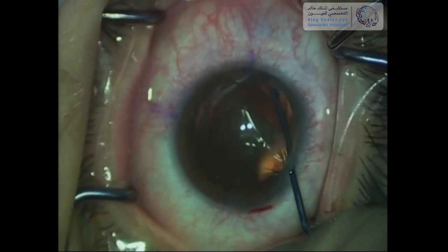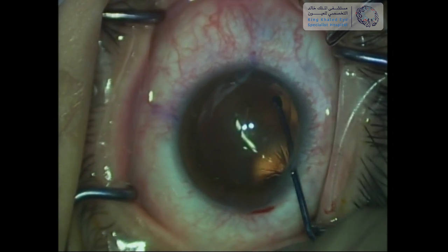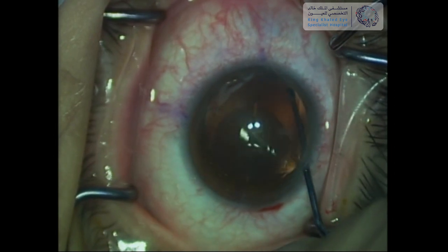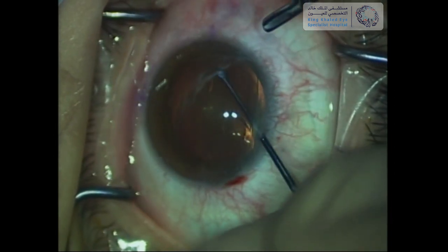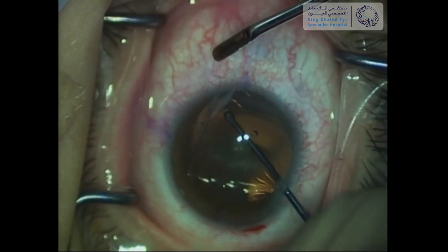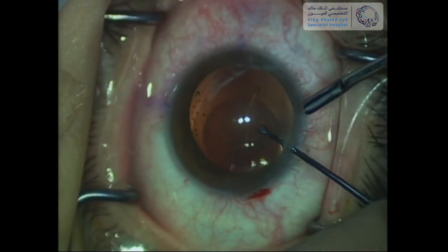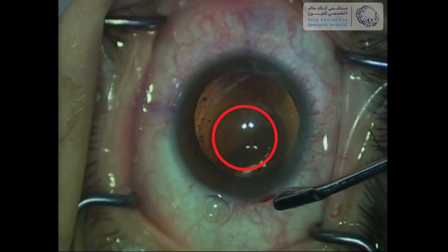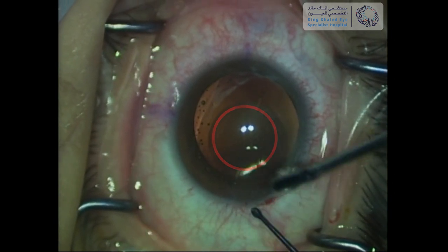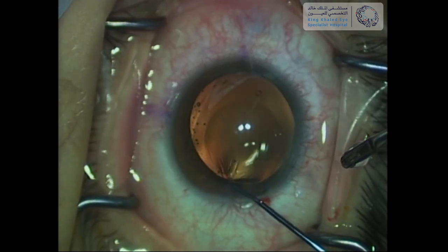An ICL manipulator is used to push the ICL footplate posteriorly behind the iris, to be placed in the ciliary sulcus. Each footplate is pushed individually in a similar manner. It is very important to avoid pressing anywhere near the central part of the ICL, as the optic is very fragile and touching it may cause scratches that may lead to visual disturbance post-operatively.